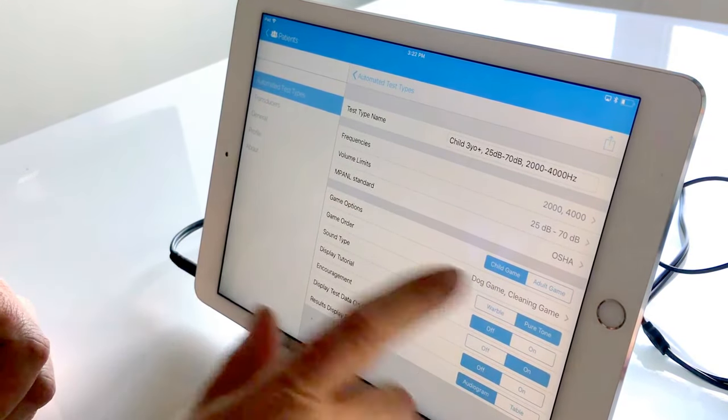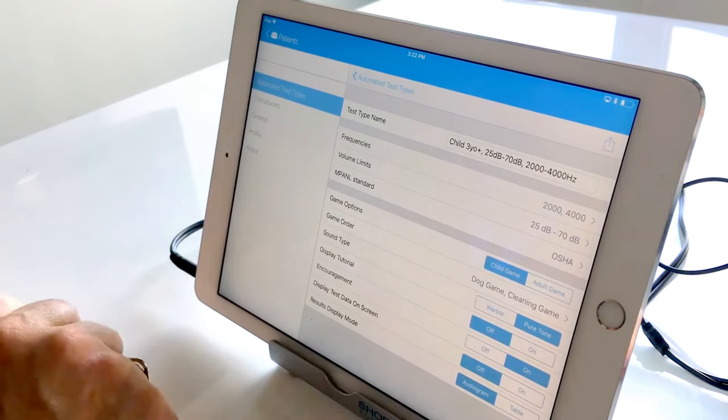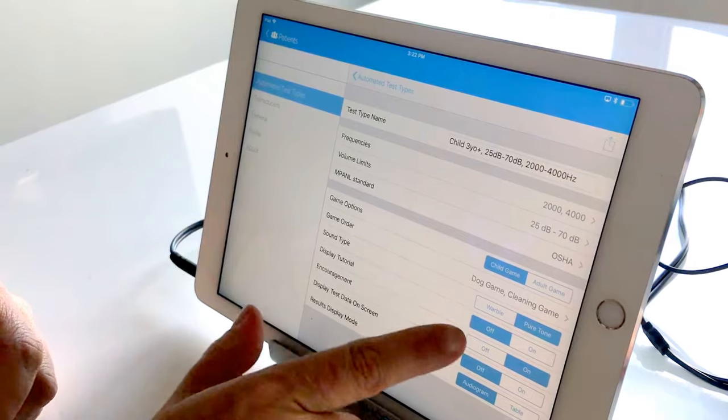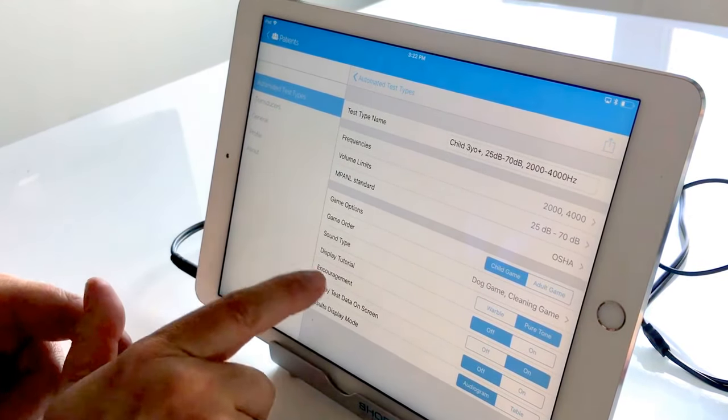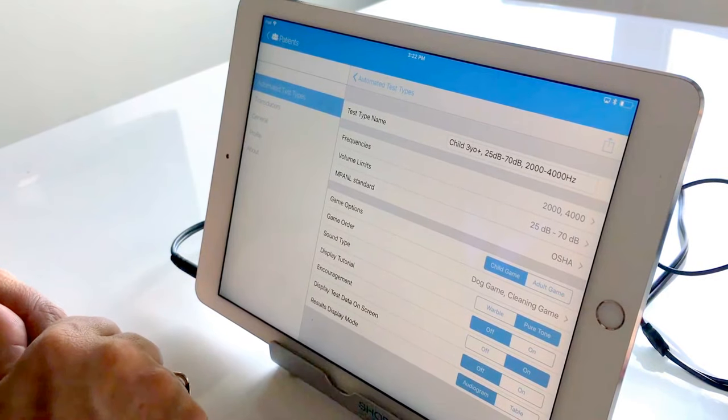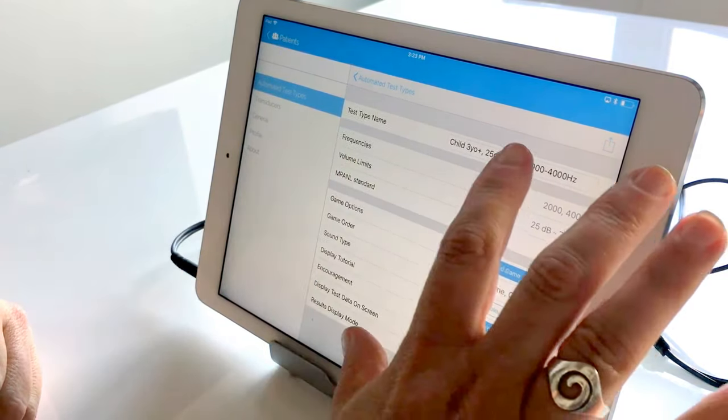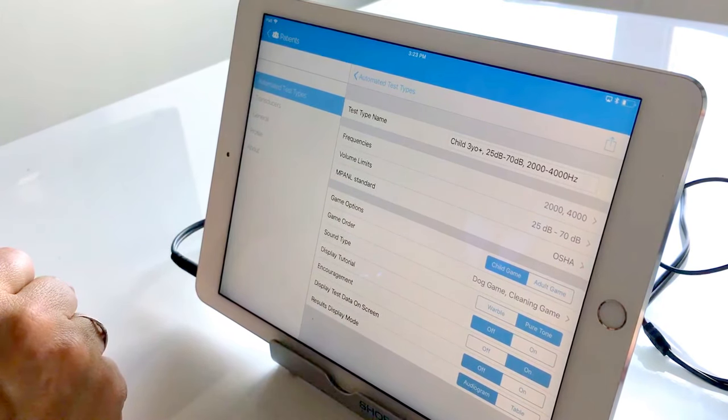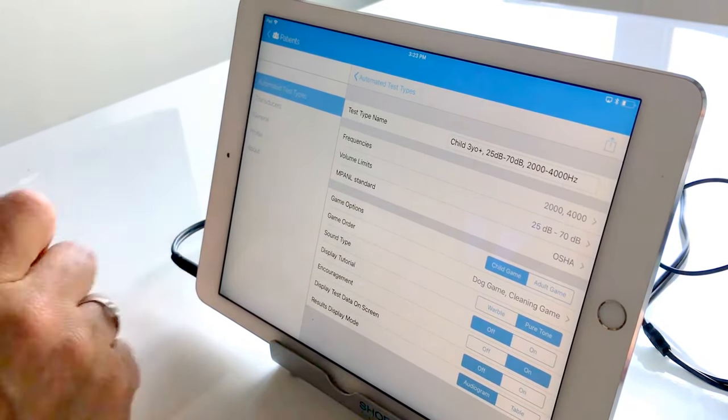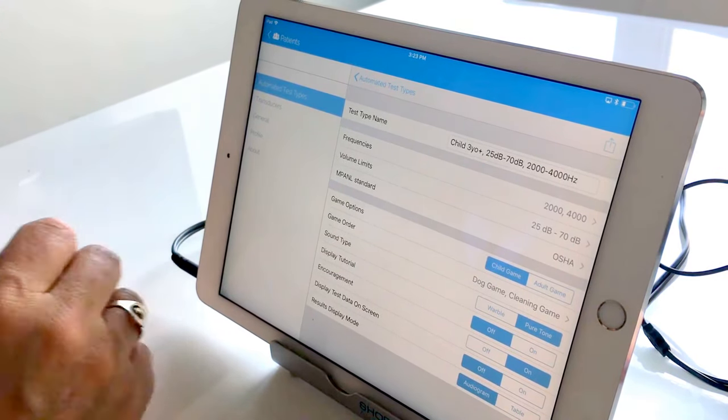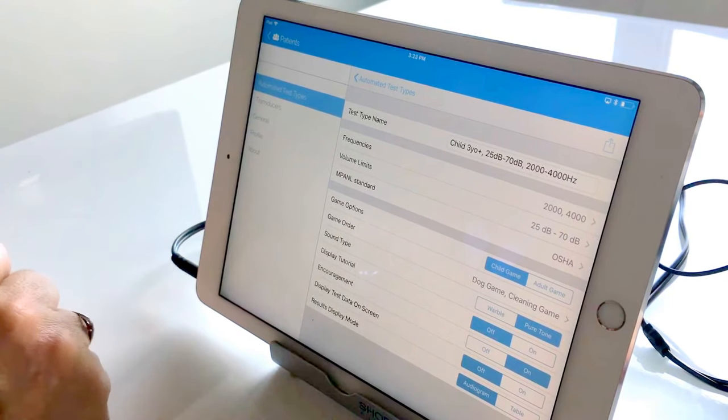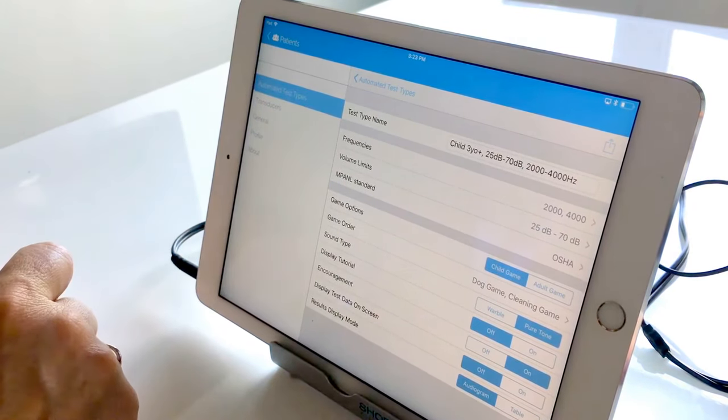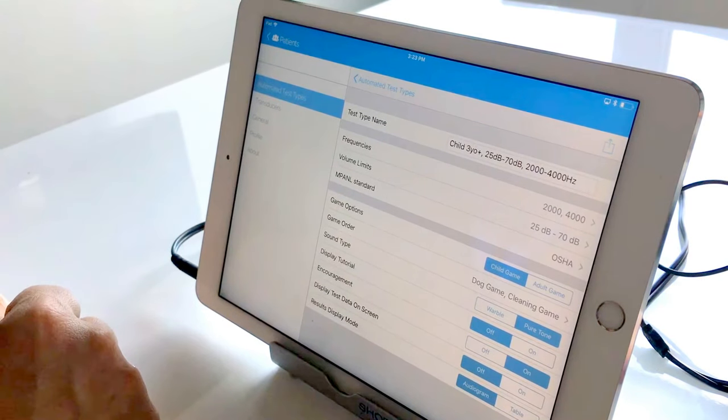So we've gone ahead and we've picked two of the child games. We're going to stick with pure tone because we're testing under headphones. The tutorial is really more adult based so we've selected that as off. We've kept the encouragement on. Now the encouragement is twofold in Shoebox. One is that you have a visual encouragement of a shooting star across the screen once you've successfully completed a frequency. But secondly there's also auditory encouragement that the child will hear under headphones such as good job or keep listening. So I find especially with the younger kids that that can really help keep their attention longer.